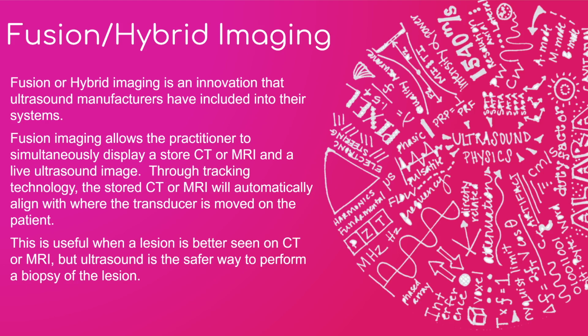Not all machines can do, oh, I take that back. All machines can do 3D, but you can only really do it if you've downloaded that package. All machines can do cardiac imaging, but you can only do all the images or all the measurements for it if you have that package. So this fusion hybrid imaging, all machines should be capable of doing it, but will only be capable of actually doing it if you bought the fusion or hybrid package that goes along with it. Anyway, long story to get around to what is fusion hybrid imaging.